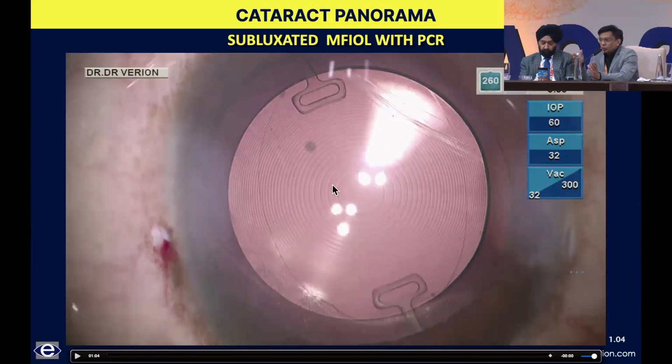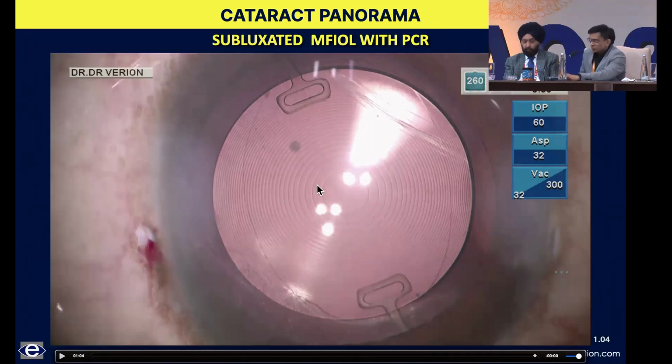If it was a 3-piece and someone was doing a Yamane, the problem in Yamane is that you have a bulb on either end, which is very good. The problem is you can't center this exactly in a multifocal the way you want it, like in a glued IOL. In a glued IOL, the advantage is you can tuck, untuck, keep on doing that till you get it bang on track. Tilt is also less with glued, because with Yamane you go across the conjunctiva, and you are not sure where you are.